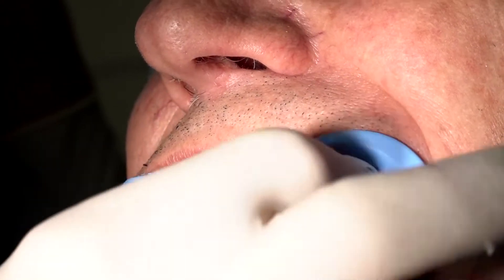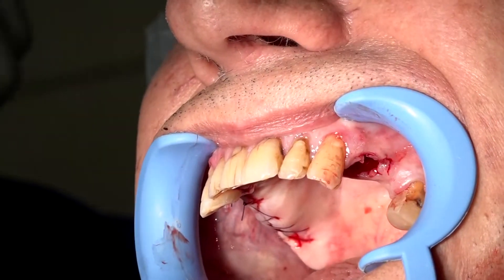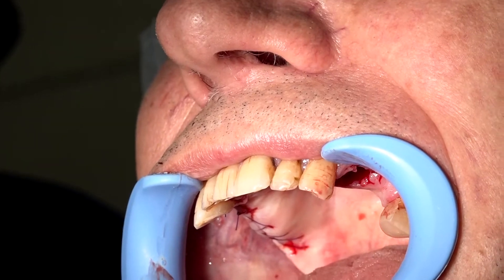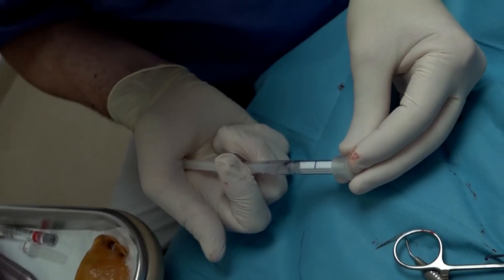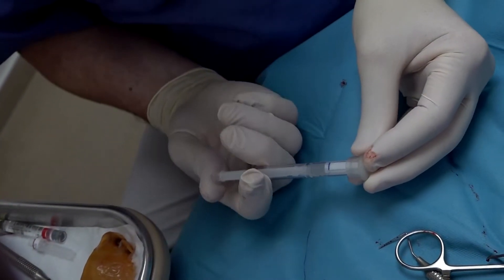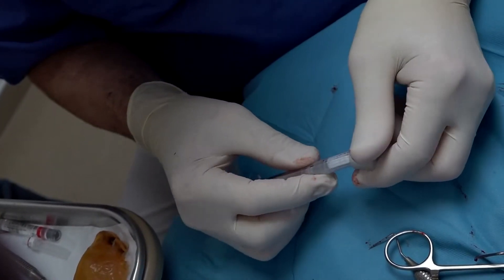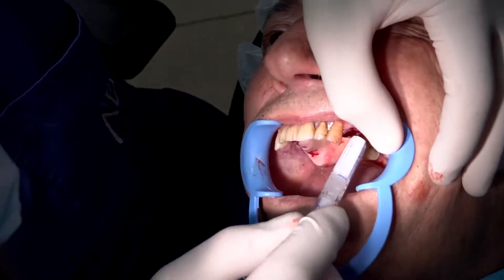Now, when the site is ready, we prepare the bone graft material. Pushing slowly the shaft until the first piston reaches the blue line. Removing the cap, and now we are ready to inject it into the site.